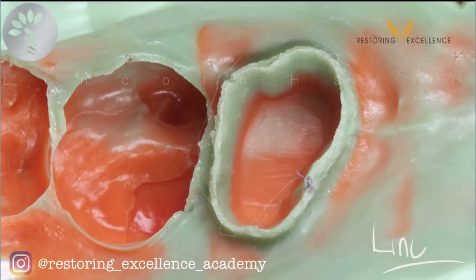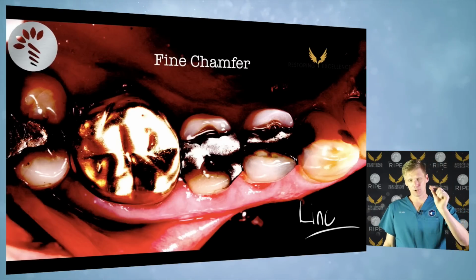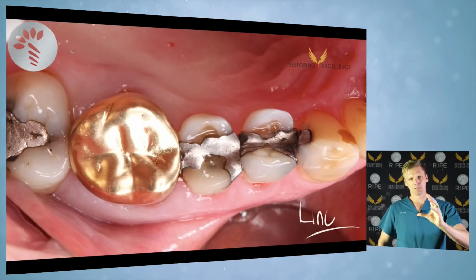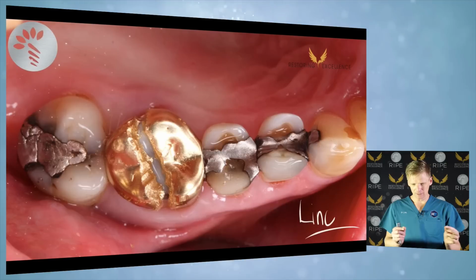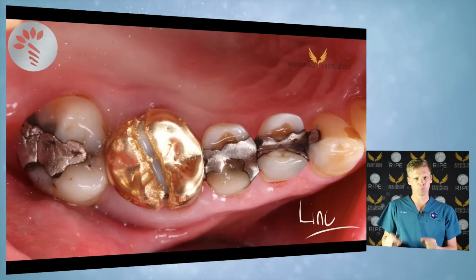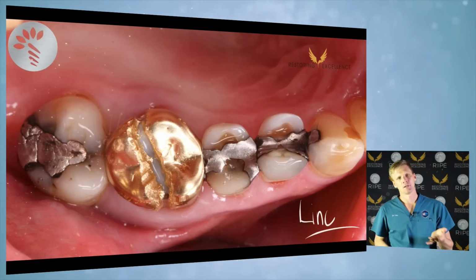Those bubbles are not consequential because there's a vertical margin, so they're going way past the actual margin. The prep goes further than the crown does. What about fine chamfers? Fine chamfers can be quite difficult because you do need to actually pick up the line of the chamfer, and it has to be crisp, but it's easy to miss. If you've got a big fat shoulder, it's easier to tell whether the silicone has hit it, whereas when you've got fine, it's easier to get a little drag and not notice.